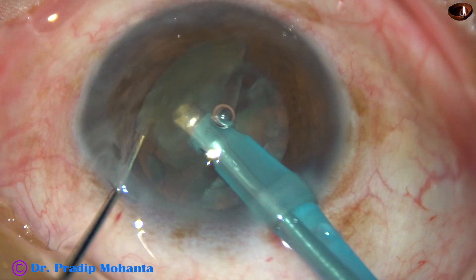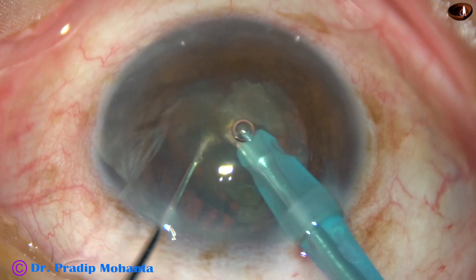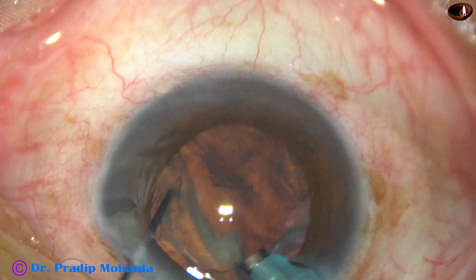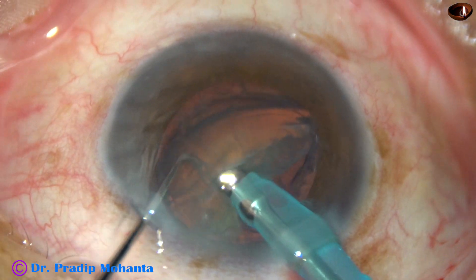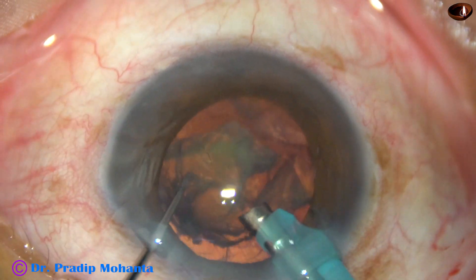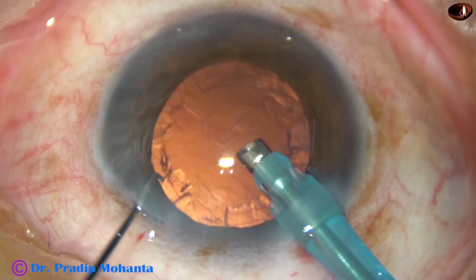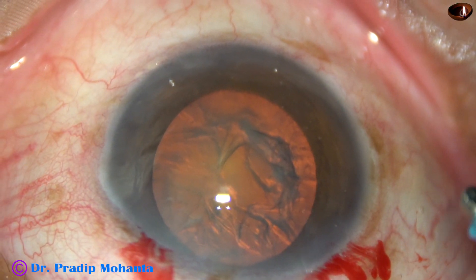The chopper comes from the periphery, near the tip of the phaco needle, and by a little lateral separation, the nucleus is divided into two halves. The nucleus may move because it is not held with vacuum, but we can divide the nucleus into two halves using this technique in soft cataracts, because in soft cataracts we cannot hold the nuclear mass with vacuum.